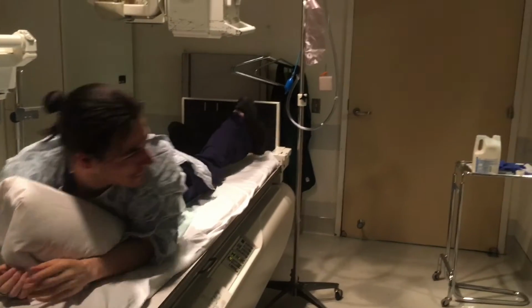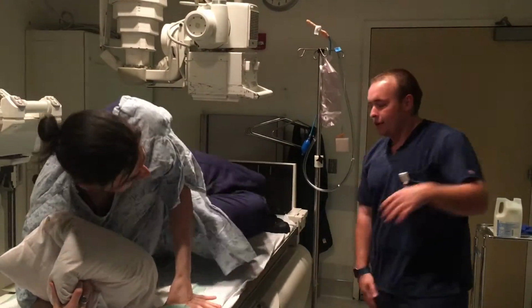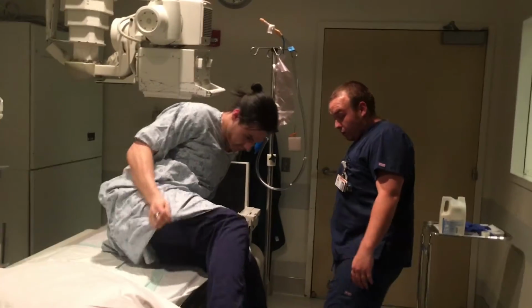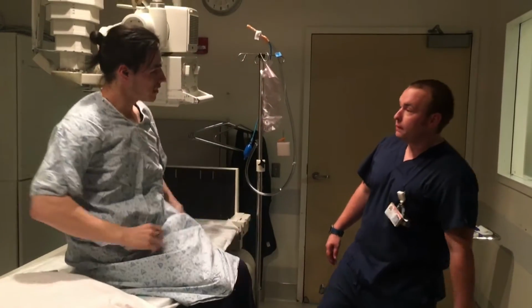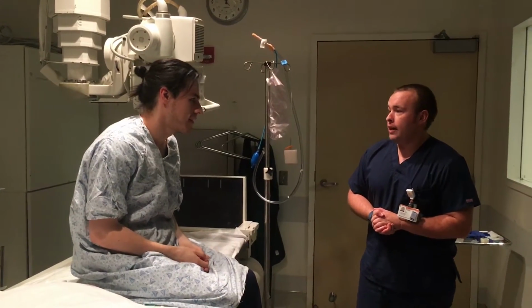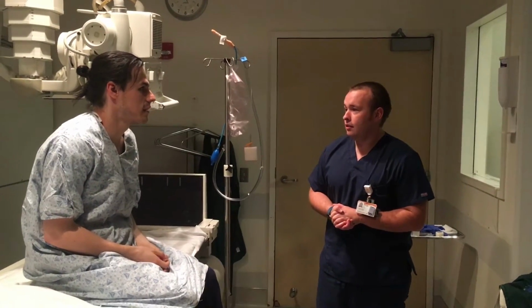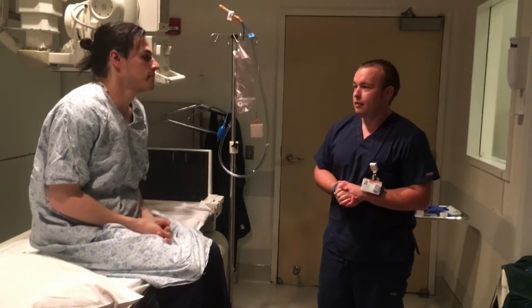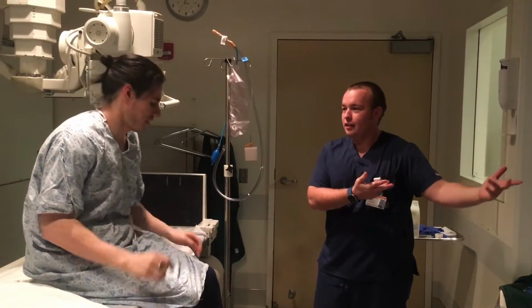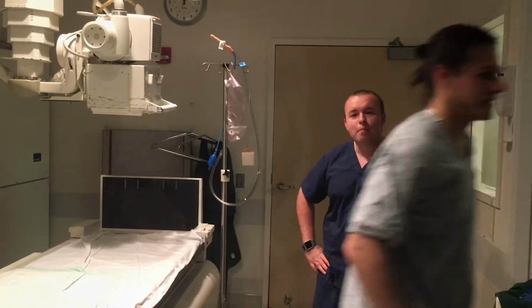Alright, it's time to get you all cleaned up. Go ahead and get changed. Just be aware that for the next day or so, you could possibly experience some white stool. Make sure you hydrate. If you don't hydrate, you could get some constipation. Do you have any questions? No? Alright. Go ahead and get changed. And that completes my barium.